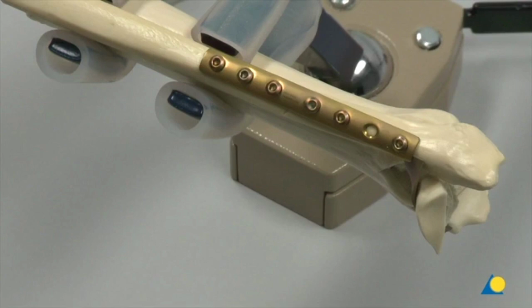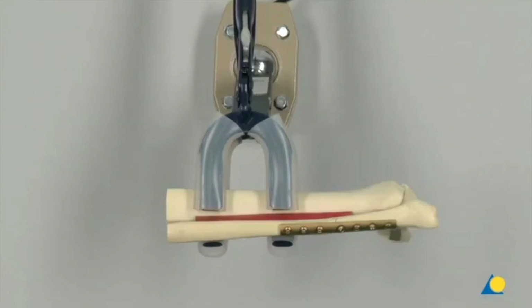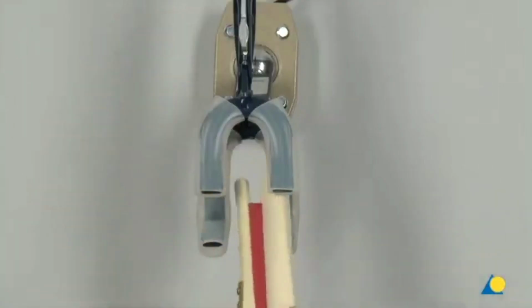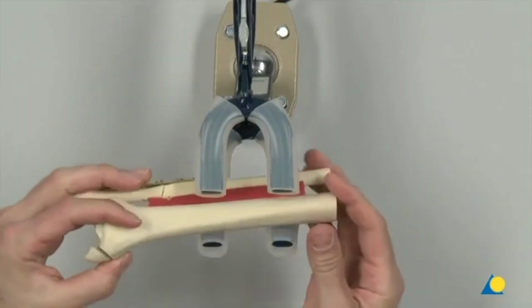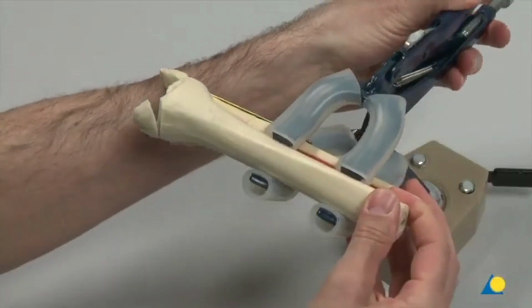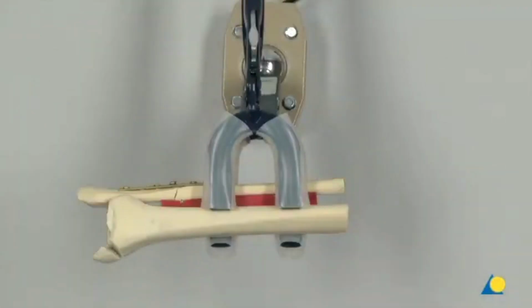All the remaining plate holes are filled, except for the second distal hole, which will be used later for the position screw. To facilitate access to the medial malleolus, the bone model is released from the clamp and rotated 180 degrees. The next step is the reduction and fixation of the medial malleolus.